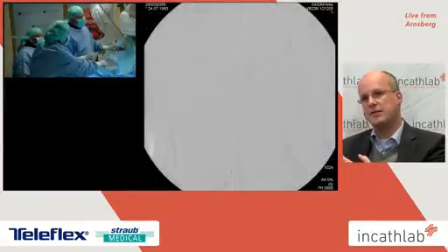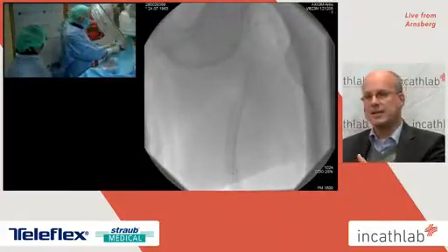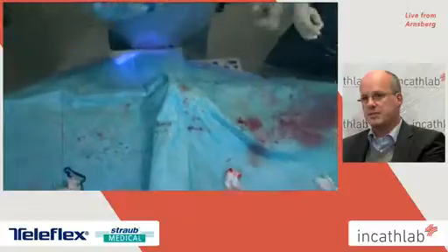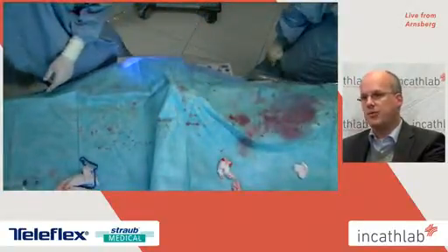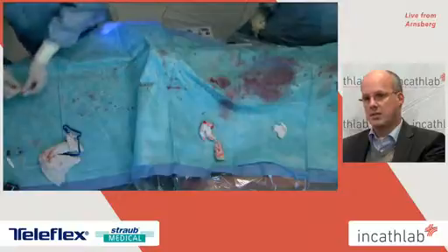And this catheter definitely needs flow, otherwise it runs dry and can really get stuck. The reason for stent implantation was to get more blood into the bypass. After this, we could very easily perform two other very efficient thrombectomy runs with the Rotarex device.